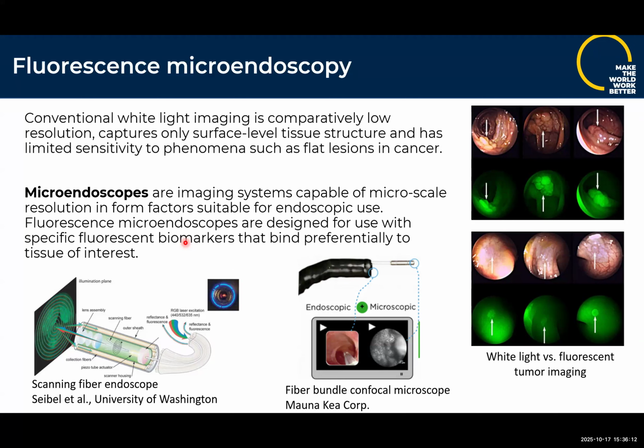Big difference between this and the white light imaging is you can see this is all being delivered by fibers, because we have to excite the fluorescent effect, they have to focus the laser on the space. In most cases, there are some exceptions. Mostly you want to focus the laser into a very finite high resolution spot and then collect the fluorescence emitted from that same location. So these tools exist.